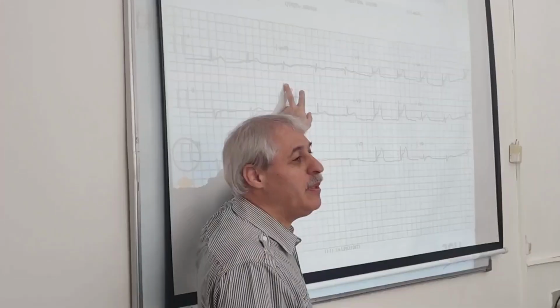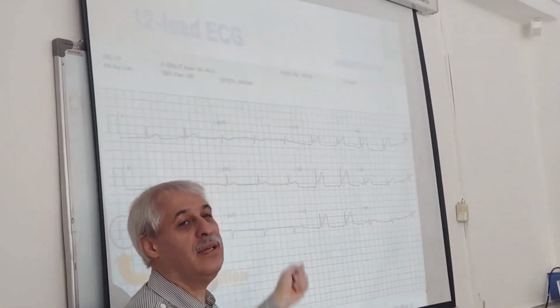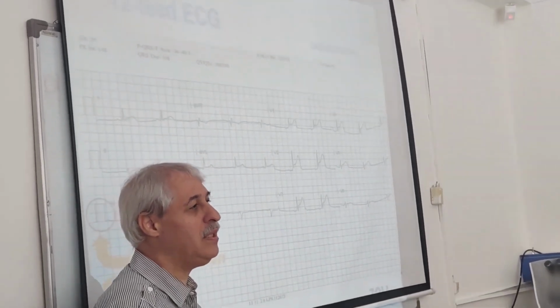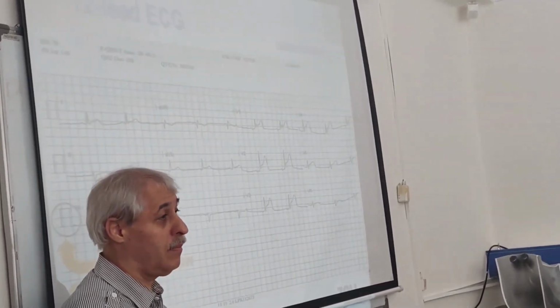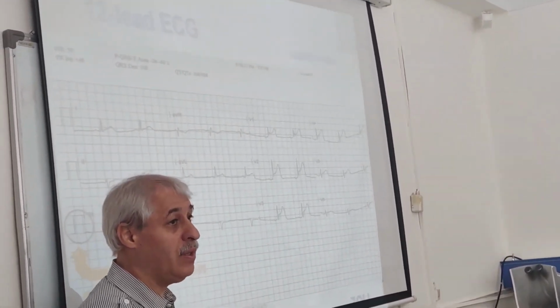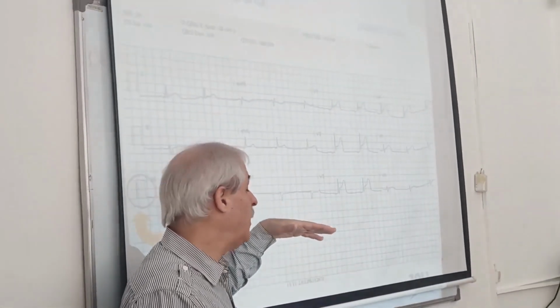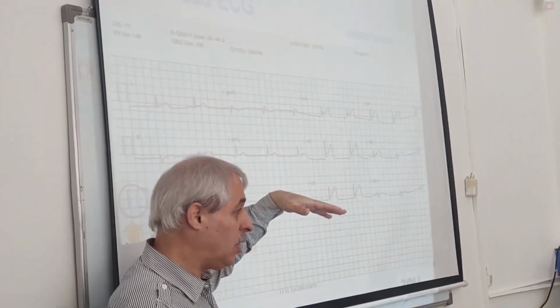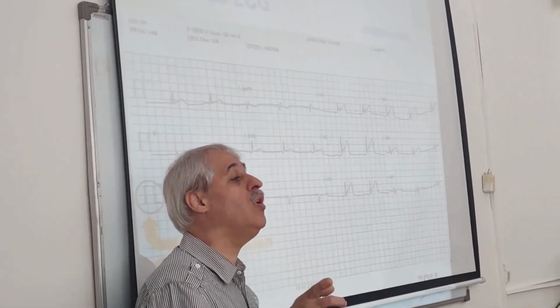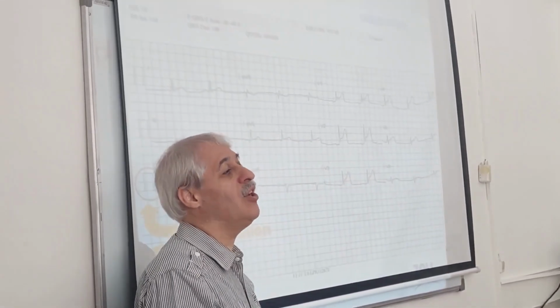It's perpendicular to the axis of AVR here in this example. How much is the AVR axis? 210 or minus 150, the picture I showed you. 30 plus 180 equals 210. So the axis is perpendicular to 210, means the axis equals 210 plus minus 90.